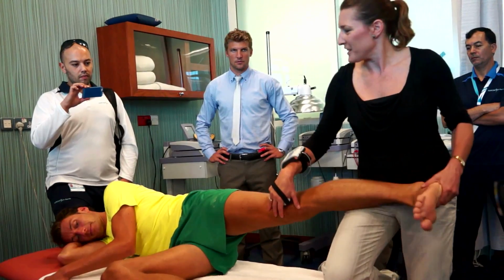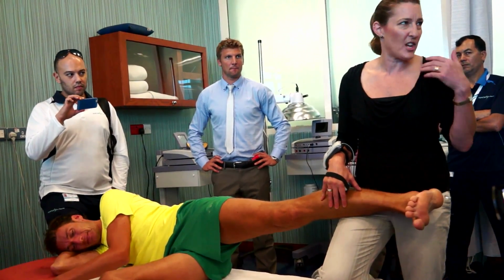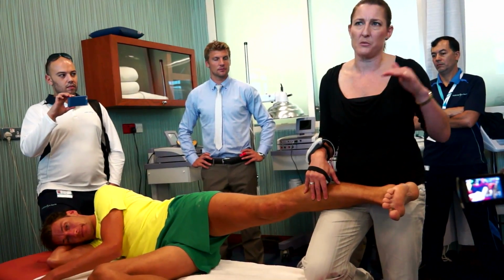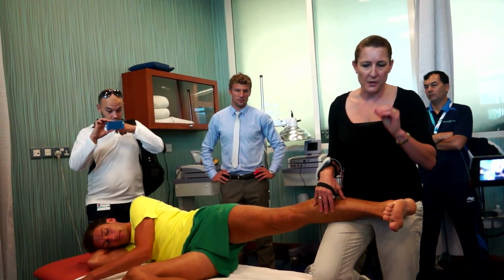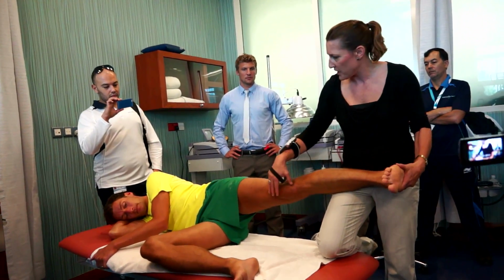We did a practice test so that we could check the technique, but also to get rid of that first contraction, and then did 3 maximal contractions and took the best of the 3. That was the method that we used. With each test, we did a 3-second isometric and then a 2-second eccentric contraction. So I'll just demonstrate that for you now.